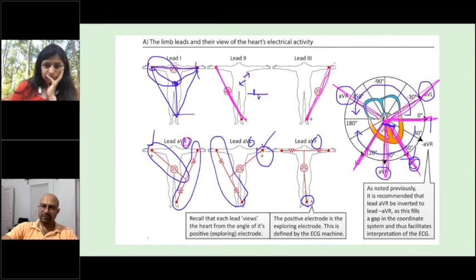Whereas if the right ventricle was getting depolarized, and this direction would usually be like this, this is practically in the direction opposite to lead 2. That means it's going in the opposite direction. This is the direction of lead 2, but this current is going in the opposite side, so it will record a large negative deflection, practically like this. And we will get a zero.